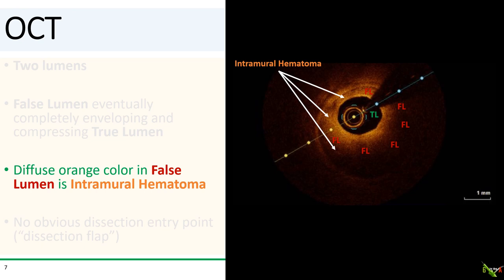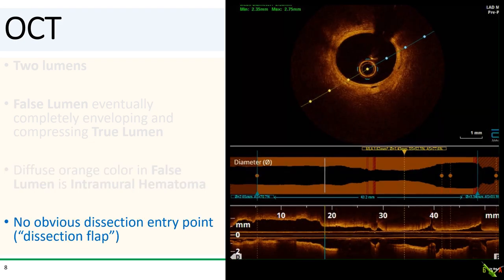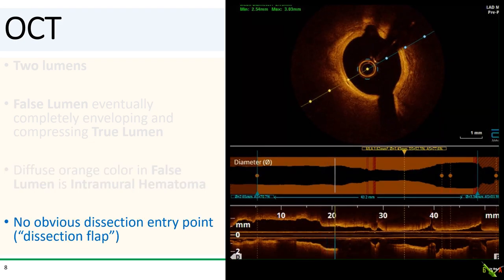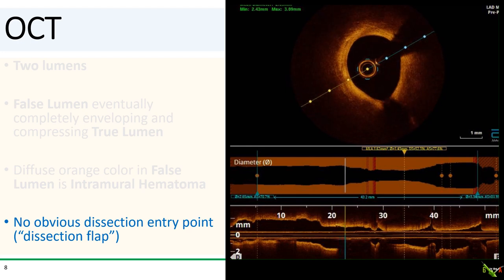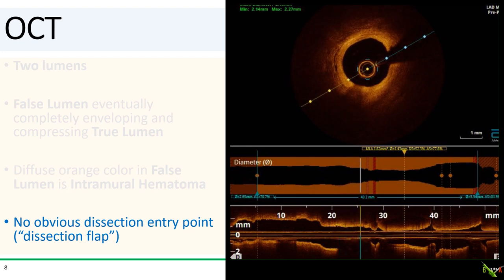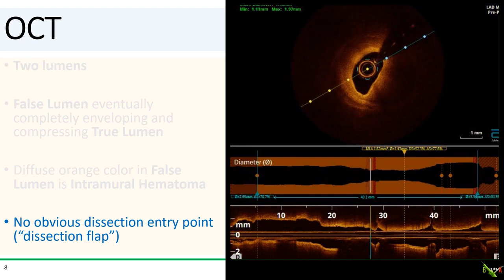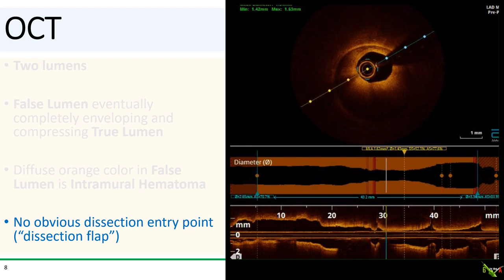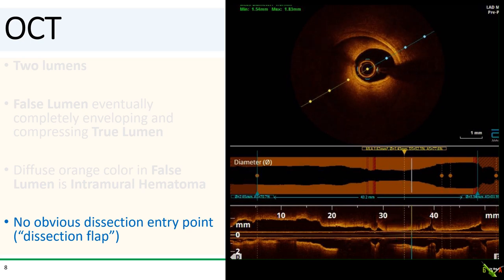We also see that the false lumen is filled with intramural hematoma, which is this diffuse orange glow. Essentially, this is blood in the false lumen. The deeper portion of the false lumen looks dark because the blood in the false lumen is blocking the OCT signal. And if we again look carefully at this run, we actually don't see a point at which the false lumen communicates with the true lumen. There is no intimal tear in the wall, so there is actually no dissection flap in this case.